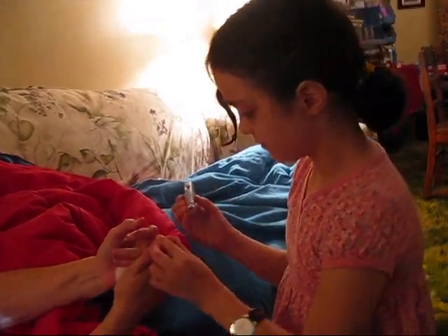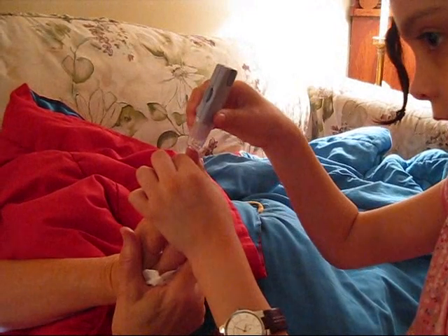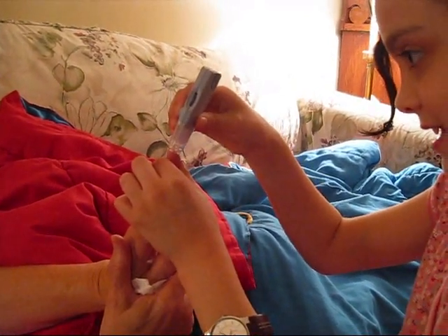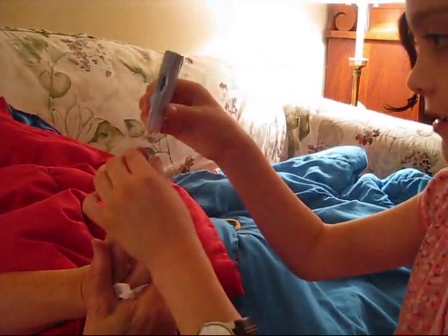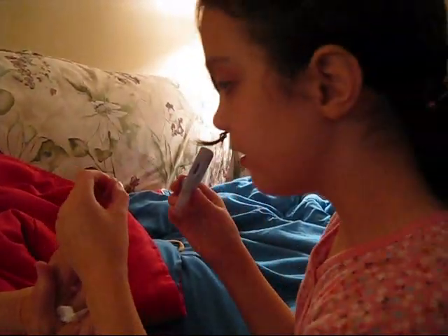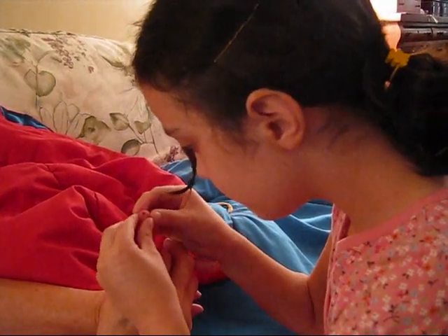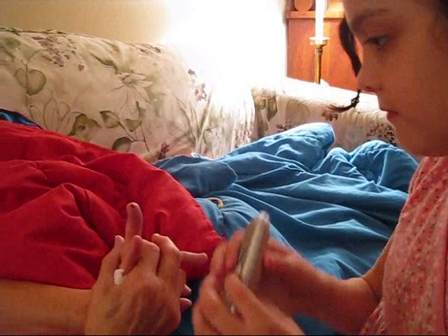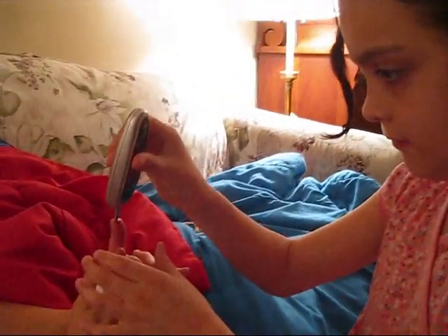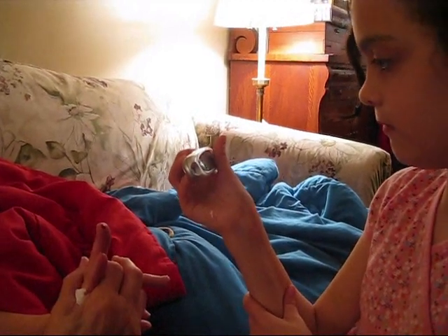This finger will not want to rest. Anything happen? Yes. Now try that part where you kind of don't touch the finger and just see if the blood goes up like a straw.